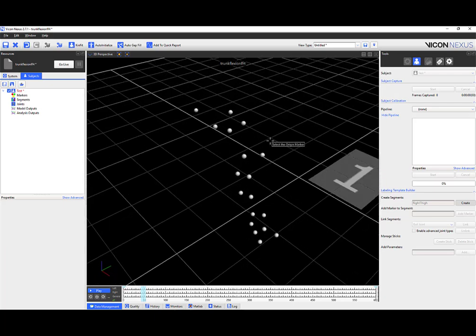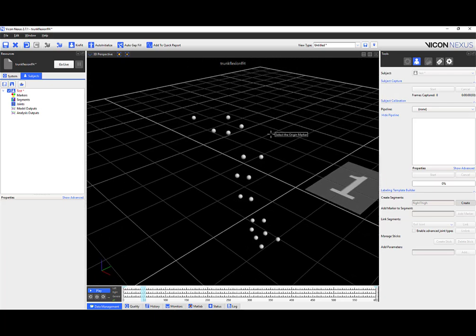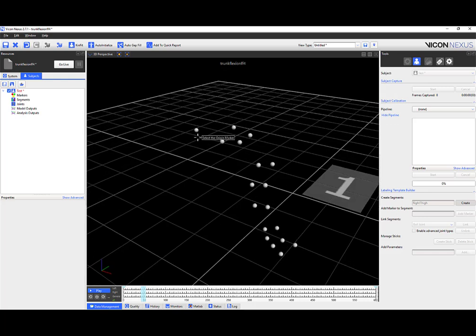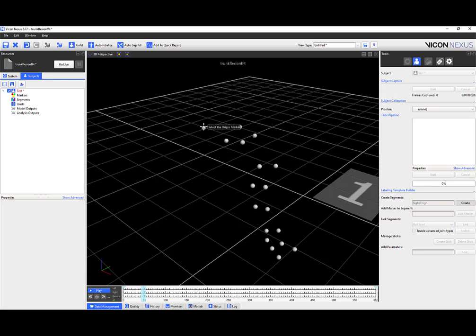So the convention is as follows. You always start with the first marker, so the closest marker. I think it's the proximal. So the proximal marker first. So hit the joints. You start with the first joint, you go to the very end joint of that segment. Once you've got the joints, you then go ahead and hit the clusters. So joint 1, joint 2, hit the clusters.